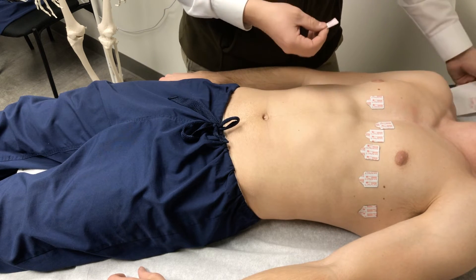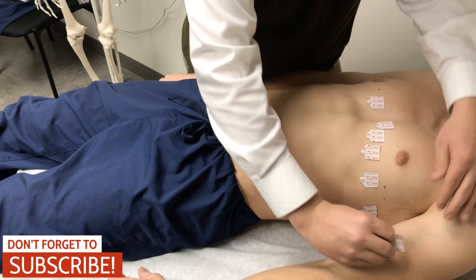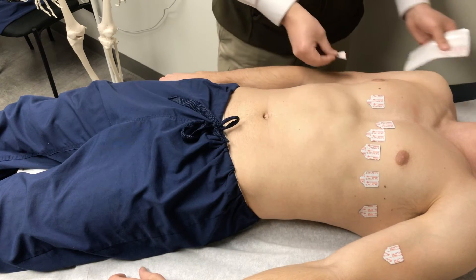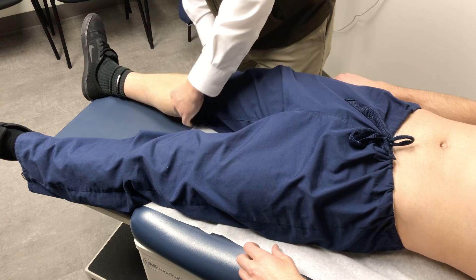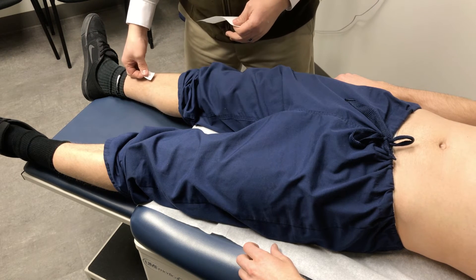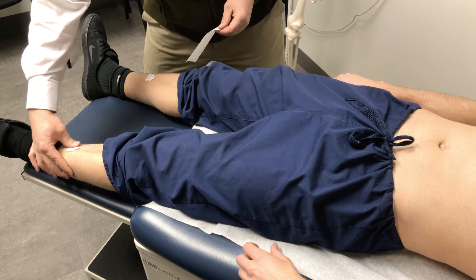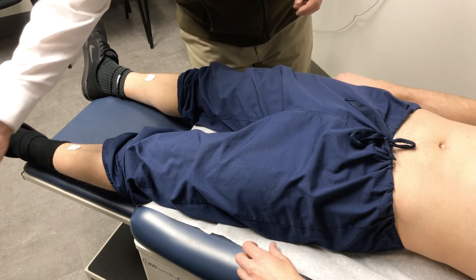For the upper extremities, we want to make sure that we're actually on the extremities. Oftentimes in the ICU I would see these being placed more on the chest wall, but we want these placed somewhere on the extremity — just down here on the bicep, or on the patient's forearm. Make sure it's somewhere on the limb, not on the chest wall. Place those right arm and left arm. For the lower extremities, we do want them on the limb. Place them down in the lower part of the extremities — sometimes on the anterior shins, or on thighs or knees — but make sure you don't place them on the abdomen and call it limb leads. Make sure it's truly on the patient's limbs.